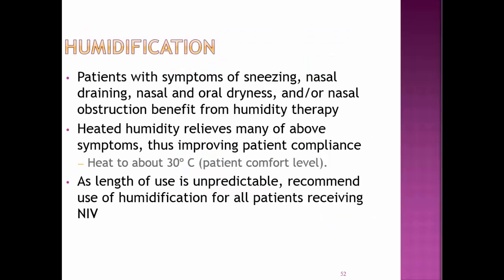Even though you haven't placed an airway, you still need to be concerned about humidification. Patients with symptoms of sneezing, nasal drainage, nasal or oral dryness, and or nasal obstruction benefit from humidity therapy. This is especially true if you leave the mouth uncovered. It takes you a little while to learn to sleep with your mouth closed. If you've been snoring for a long time, your mouth is typically open, and it will take you some adjusting to. And when your mouth comes open, what happens is this flow just dries your mouth out.